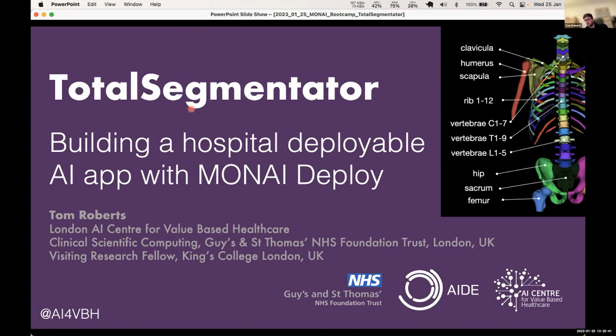No, so they don't have to be. AIDE will work with FDA, UKCA, and apps that are not approved in that way. AIDE is going to be rolled out in the next 3 to 6 months across the different trusts, and then the process for getting apps onto it will be to effectively, in the short term, submit them to us for approval, and then, if it's not FDA approved, agreements will need to be put in place, licensing between the hospitals and the app developers so that they can be run at the different hospitals.